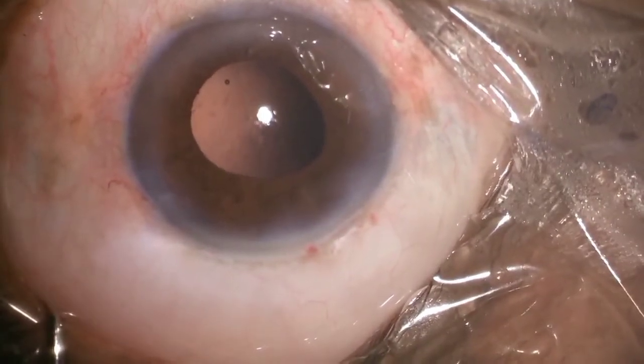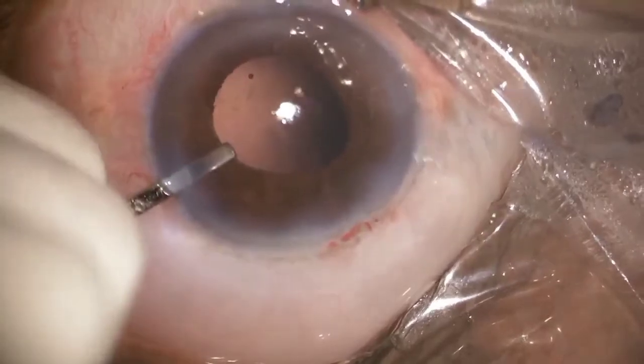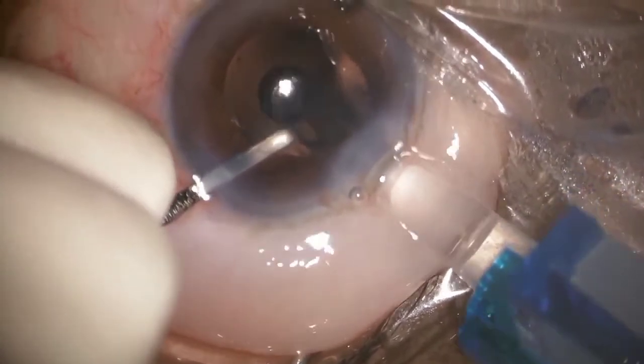so that it won't be difficult for the injector to get inserted in the wound. Prior to inserting the injector, initially it slipped on the epithelium and caused some epithelial defect, but it was noticed later on.